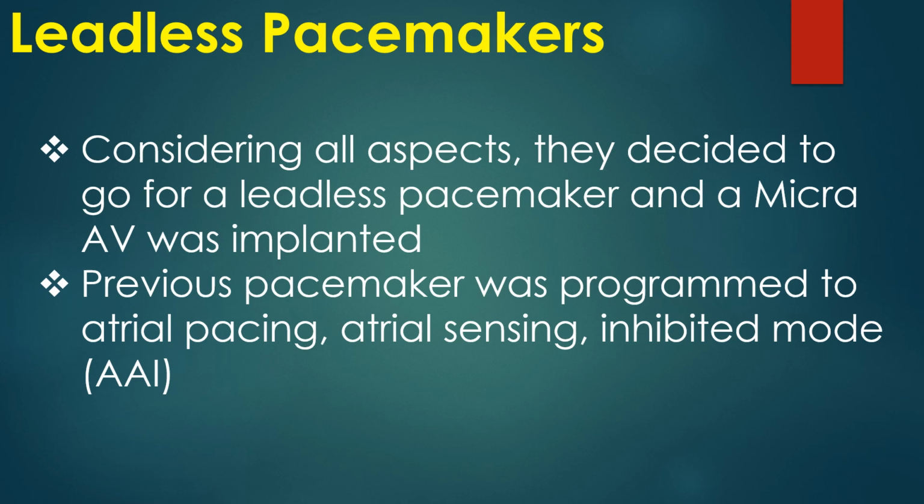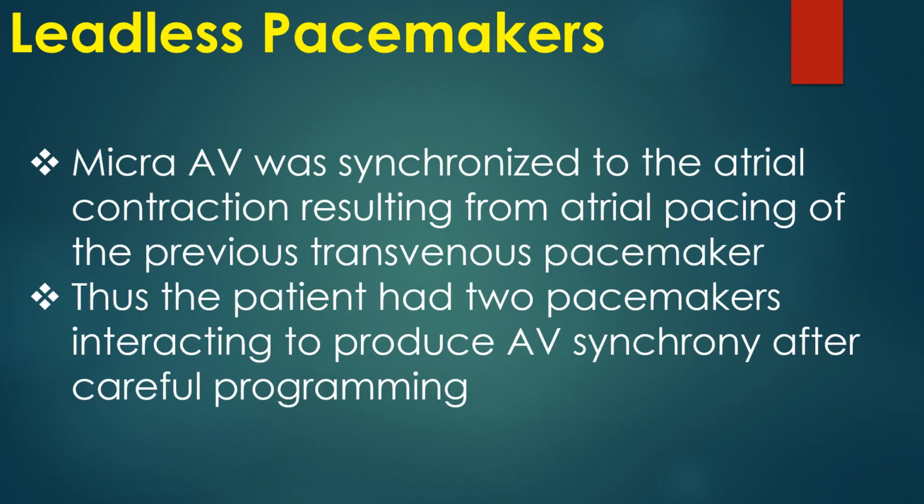Previous pacemaker was programmed to atrial pacing, atrial sensing, inhibited mode. Micra AV was synchronized to the atrial contraction resulting from atrial pacing of the previous transvenous pacemaker. Thus, the patient had two pacemakers interacting to produce AV synchrony after careful programming.